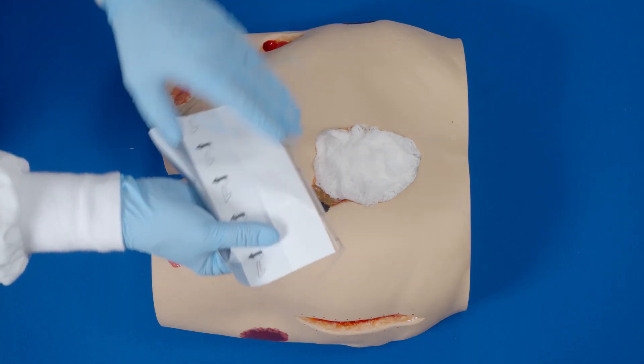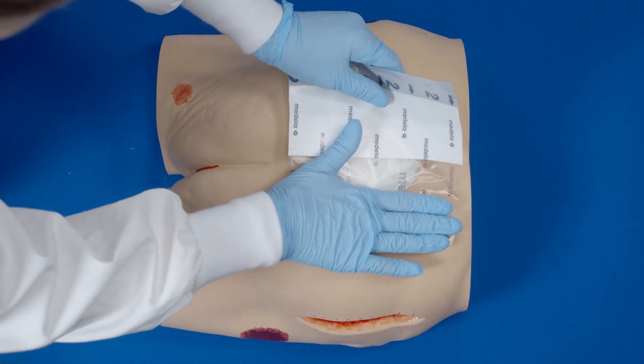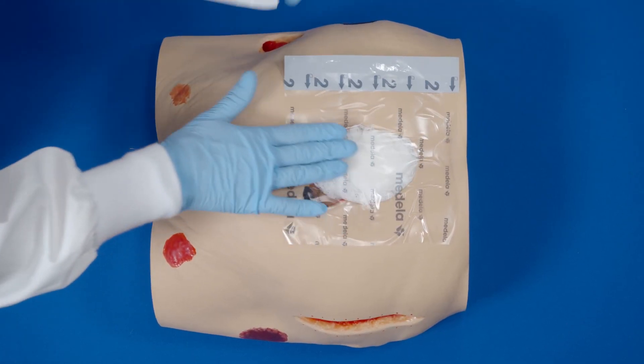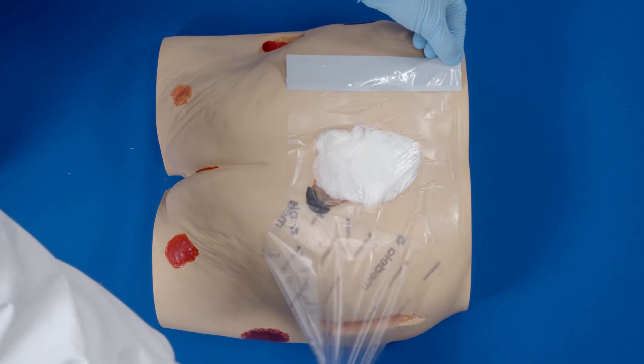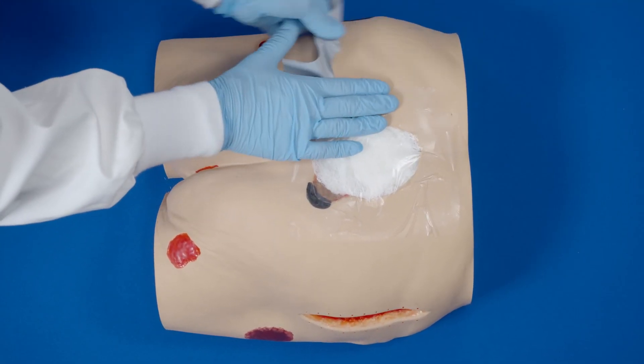Partially peel back one side of layer 1 and place adhesive side down. Then remove the remaining side of layer 1. Now remove the backing or layer 2. Remove the perforated silver colored tab on the side.